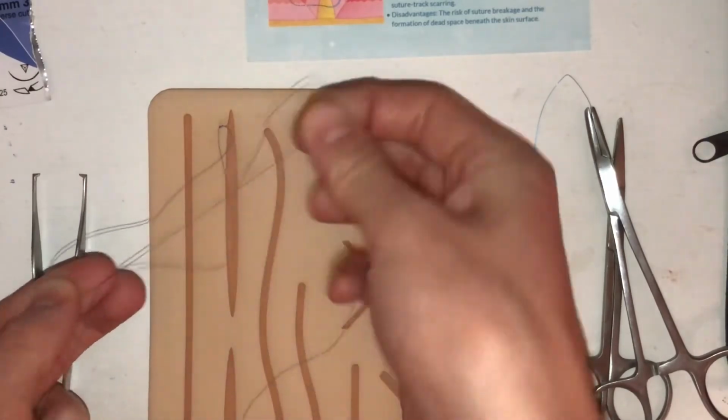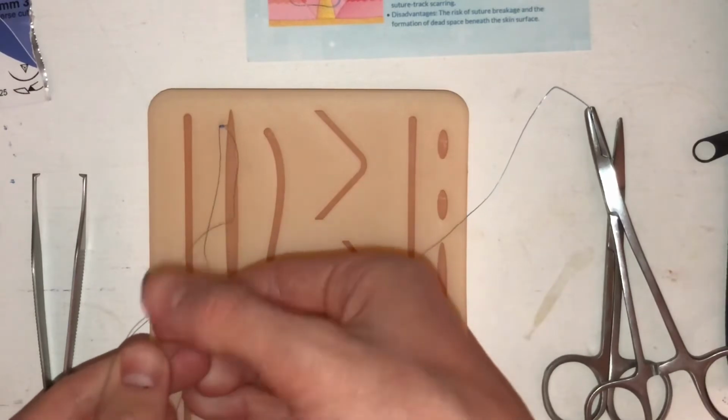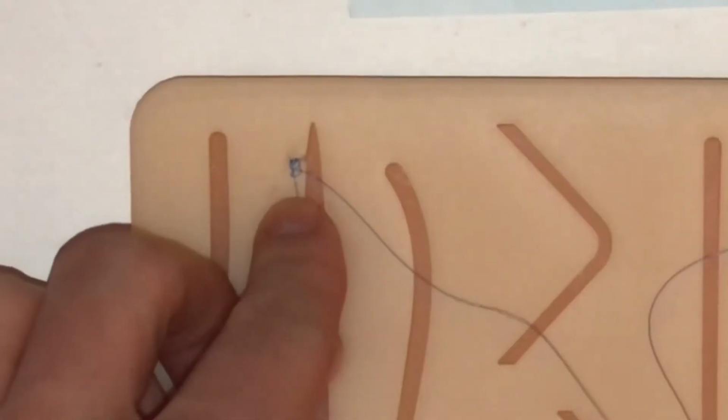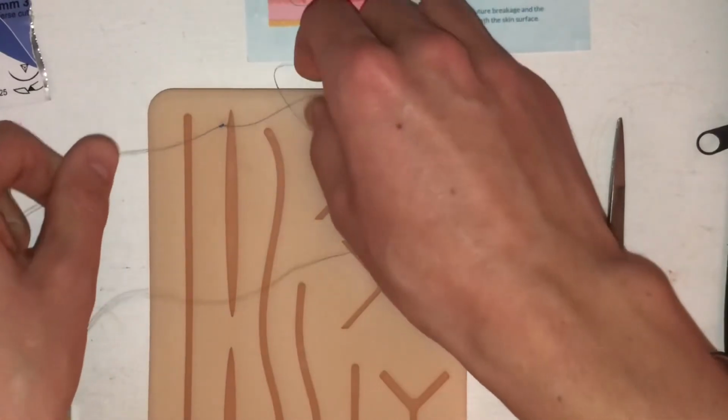And obviously I would have gloves on, or it would be sterile, because I wouldn't ever want to just touch the patient. But here's what we're doing. We're just doing a little knot like that, and you can kind of see how it's a little bit longer. And then she just cut off the end, and that was just the base.